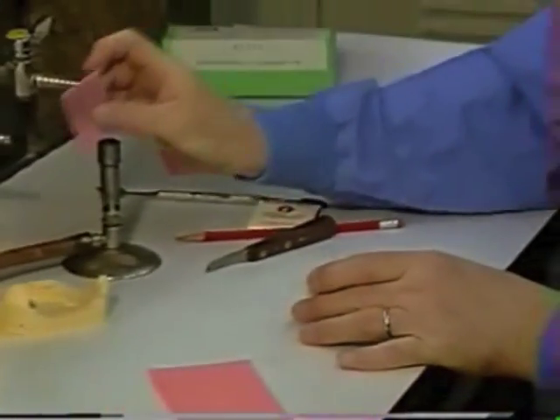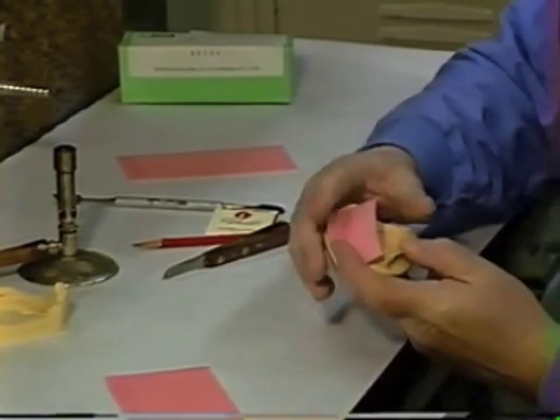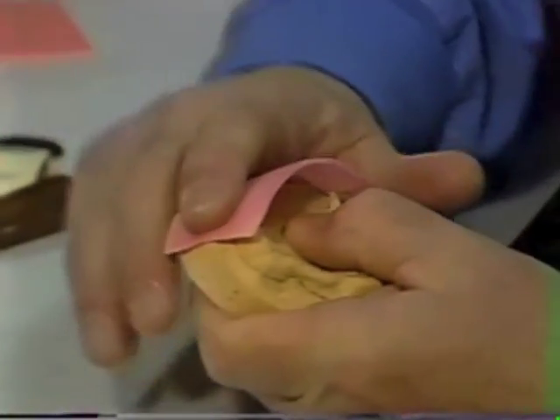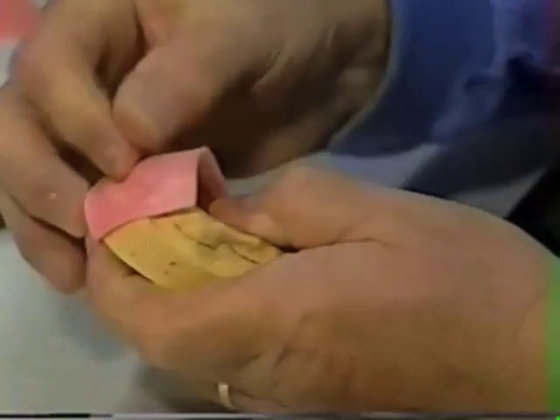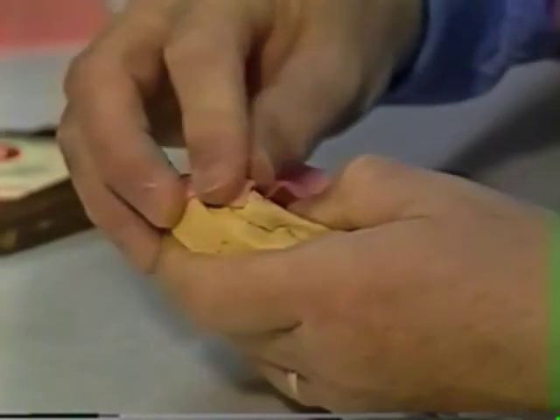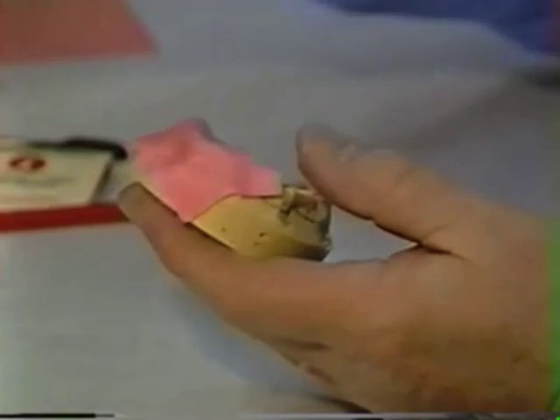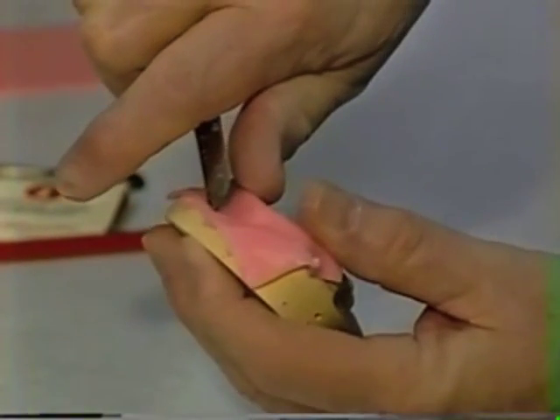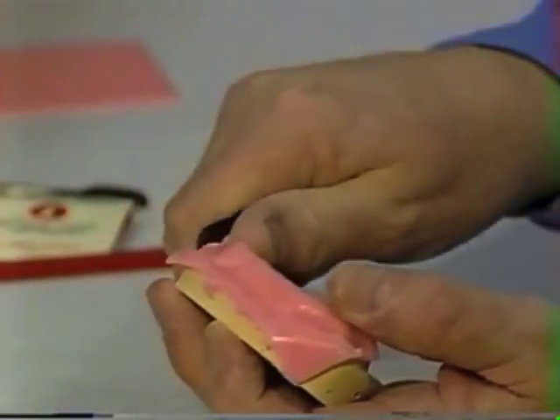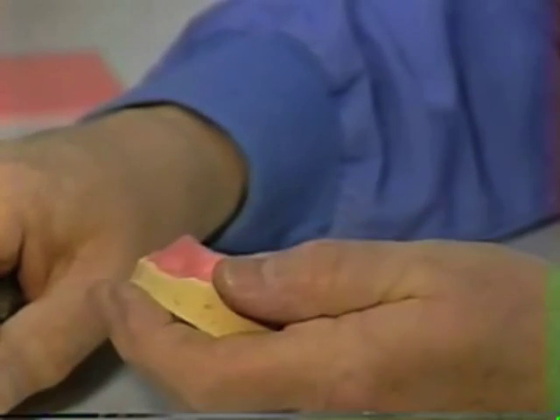So we're going to heat that nice and pliable, get it nice and soft, and lay that 1 layer of base plate wax over the cast and adapt it real well and real tight to the cast. Once you have it adapted, I will usually take a knife and cut off the excess, but I cut that excess off to the depth of whatever that primary cast gave us. Do not cut it off to your planned height of where you want the tray to go.